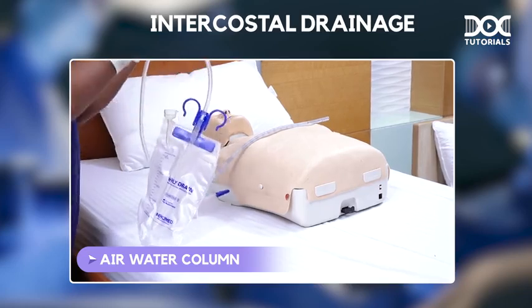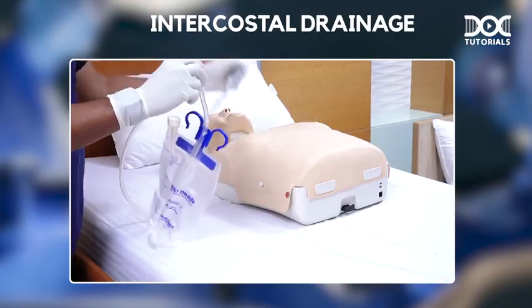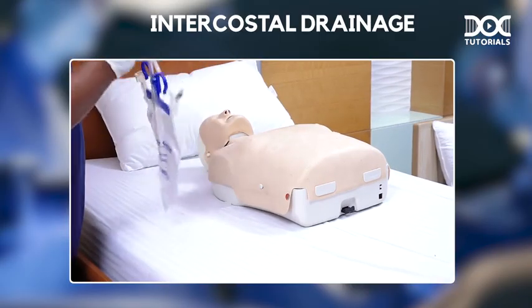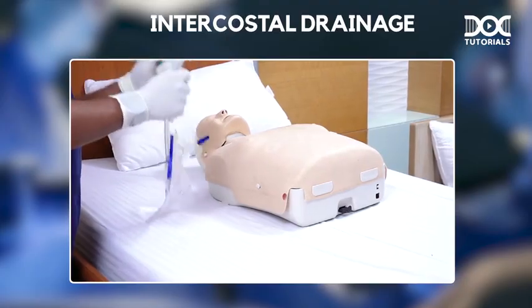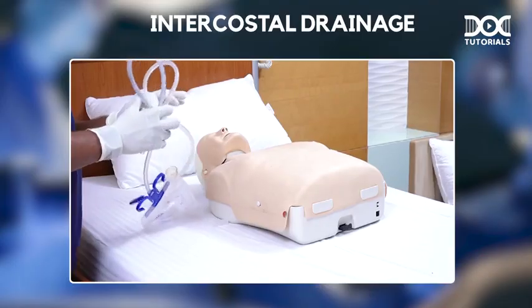So this is about the intercostal drainage tube. Please remember all the salient points of putting an intercostal drainage tube, which is a very important procedure for interns as well as for residents. So this is a very important procedure either in an elective situation, also in an emergency situation. So please don't forget about the intercostal drainage tube.